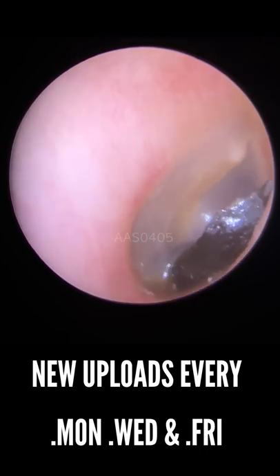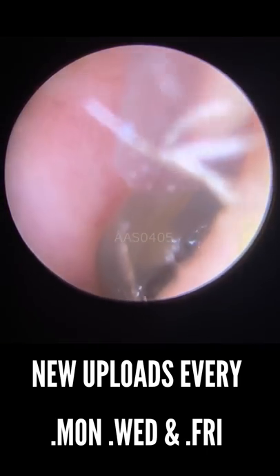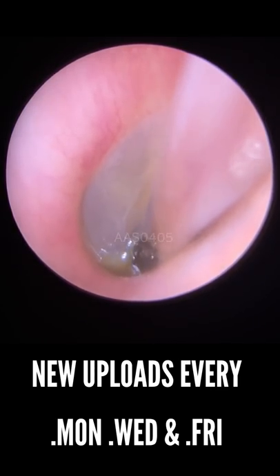You can see this patient has come through with a very, very deep piece of wax. It's almost like a little bit of stone — a very, very hard piece right down against the eardrum. So a little bit uncomfortable for the patient, and they had been experiencing a few mild tinnitus symptoms as well.